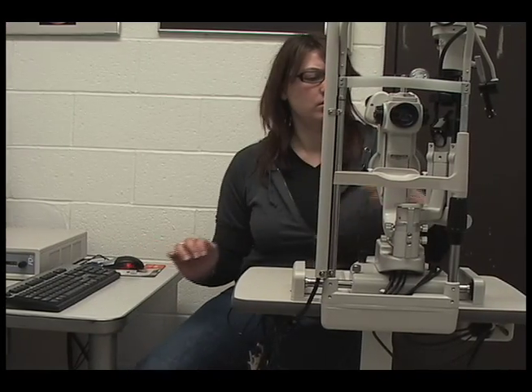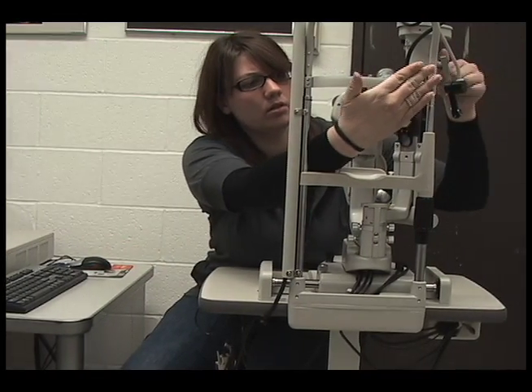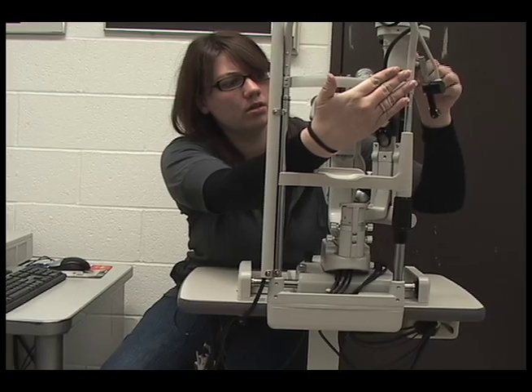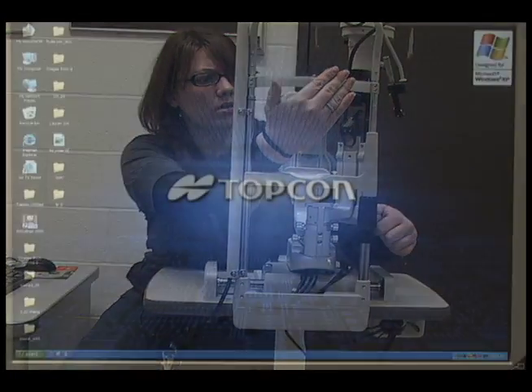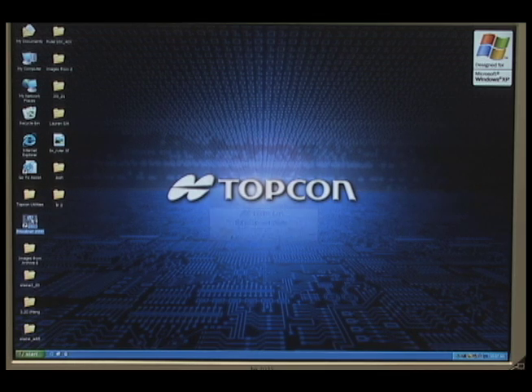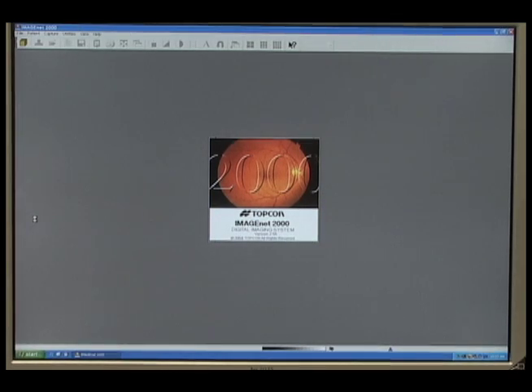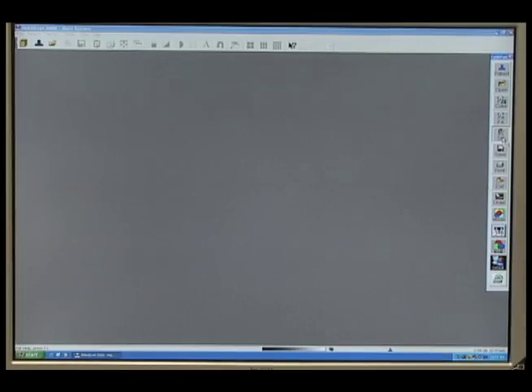In digital imaging, the camera is tethered to a computer and software to capture the images. We will use the TopCon software. Once you open the program, click the slit lamp button and create a patient file.